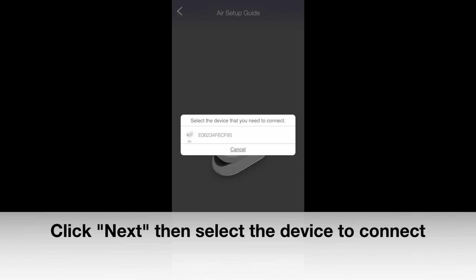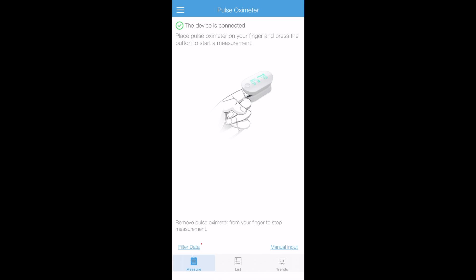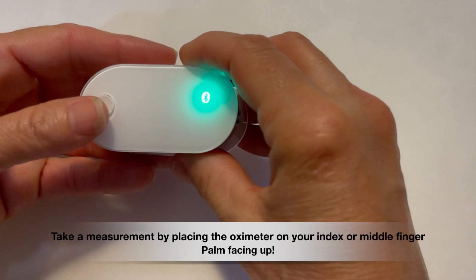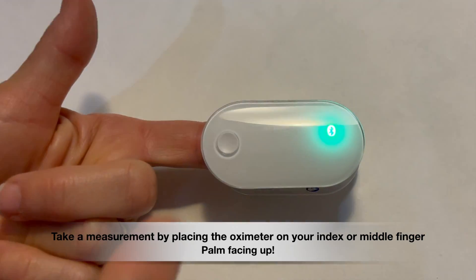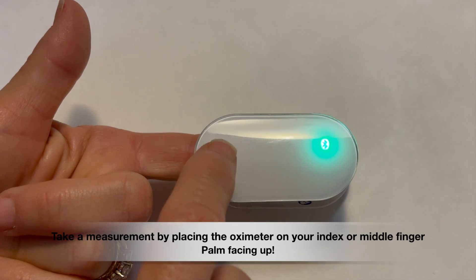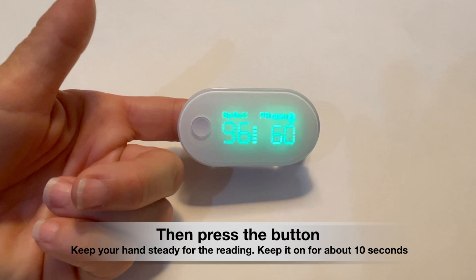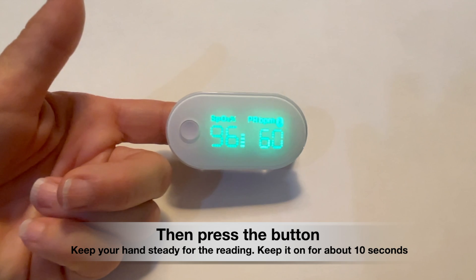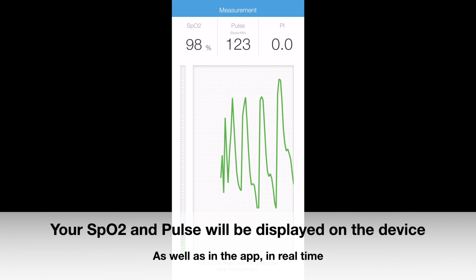Once the screen states that the device is connected, you are ready to take a measurement. Please remember to have the iHealth app open each time you take a measurement. When you are ready to begin, be seated at your vital station and place the device on your index or middle finger, as shown, and remember to have your palms facing up. Press the circular button on the top side of the device and it will start taking your measurement. Try to keep your hands steady for the reading. Keep it on your finger for about 10 seconds and then remove the device.